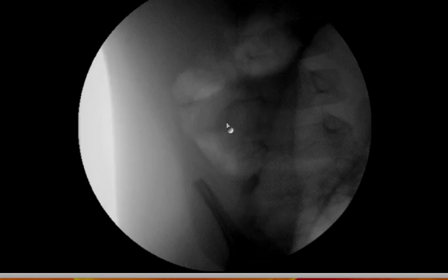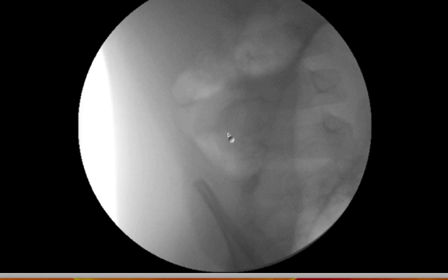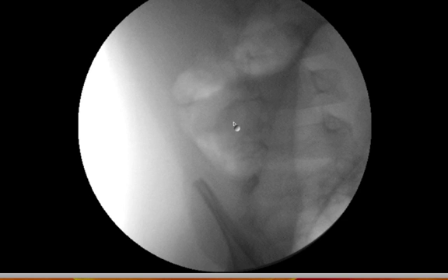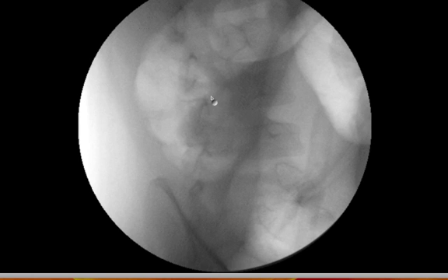When we were able to oblique her, we got that redundant sigmoid colon out of the way. Here we have the right colon coming down, and this filling defect — this bulge sticking into it. Air in this image is going to be bright white, so the filling defect will be darker. Here you have air in bowel, and here you have this filling defect. This is the cecum. This is where we want to see the small bowel connecting, and we have this filling defect here instead.